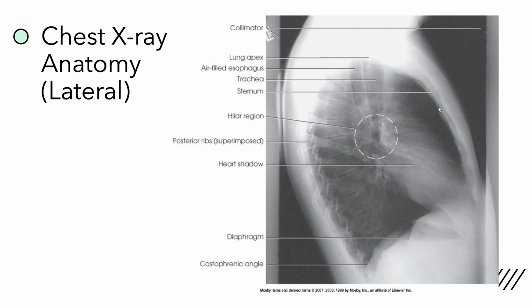So if we have the arms in front of them and they're superimposing over those spaces, it's not always the best quality of image. So if possible, if the patient can do it, it's best to keep those arms over the head holding onto that bar. If patients are also a little unstable, it can help to hold on to something. We also have the vertebrae here. We can see a nice thoracic spine, and then those ribs that are articulating, or forming a joint, with the thoracic spine coming off of them.